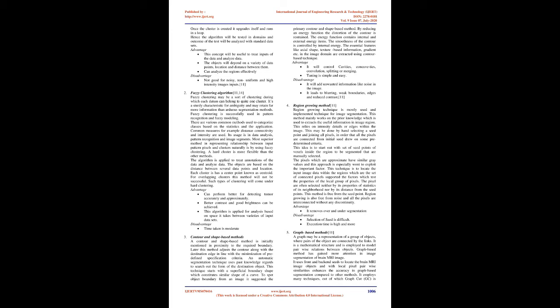Advantage. Widely used for MRI image enhancement. It retains sharp features and edges in the image. Reduces contours and noise in image. Disadvantage. Not optimal for varying noise. B. Image segmentation. There are many techniques used for segmentation.